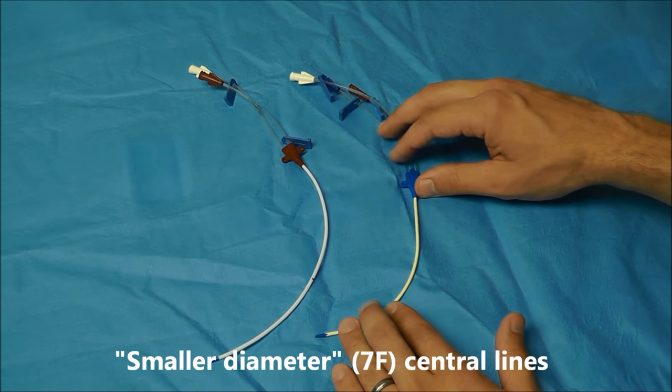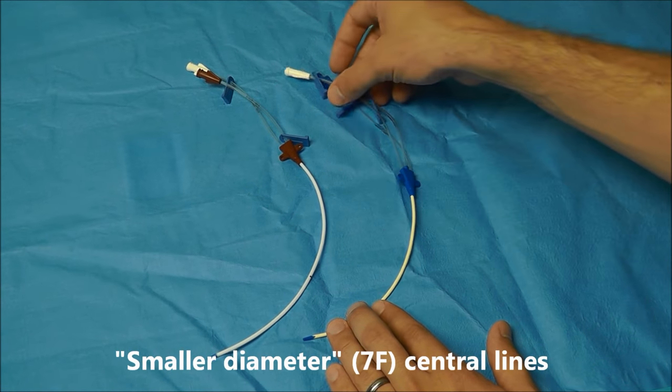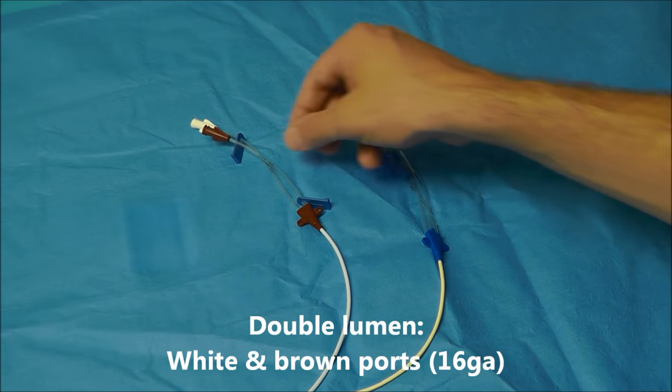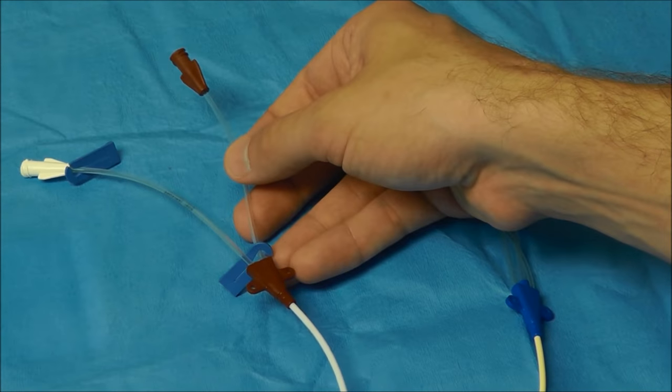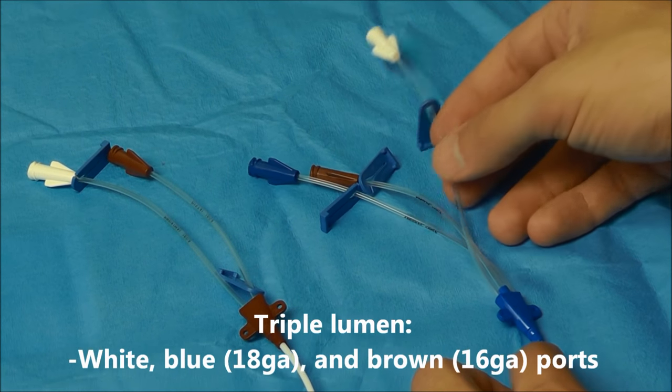Starting off with these smaller 7 French diameter central lines, some of them are just double lumen and then some of them are triple lumen because they have three lumens.